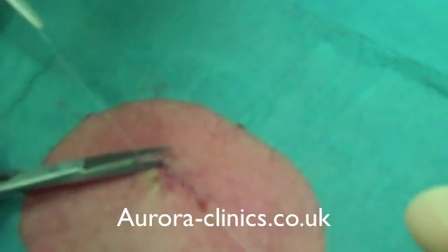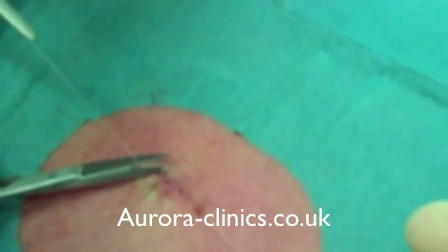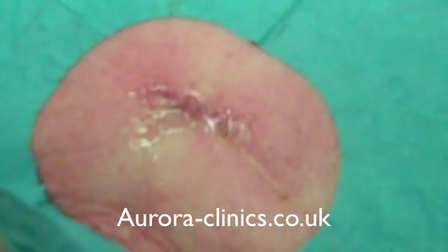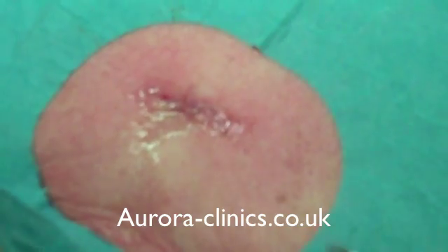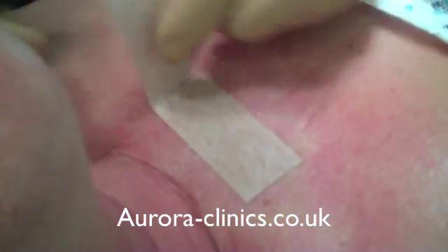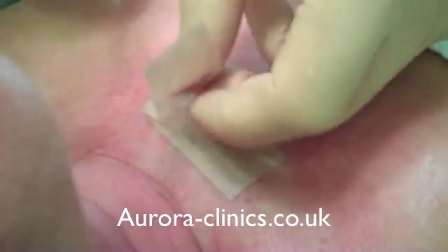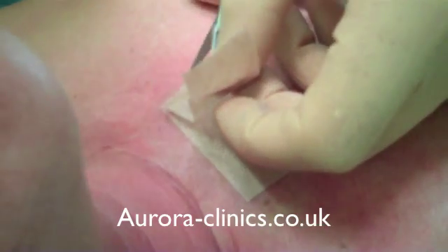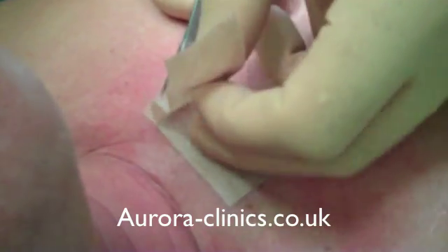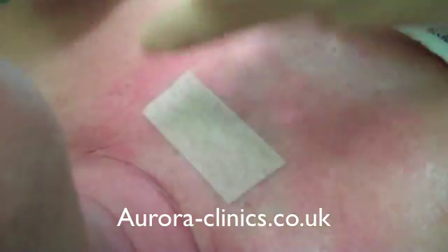You can see there — that's where I'm going to cut the stitches after surgery. Here's the glue going on, and finally here's the micropore tape, which we like to keep on for one week following surgery. Then that comes off and the ends of the stitches are trimmed.